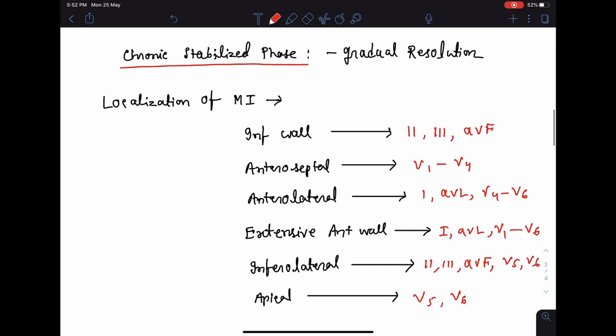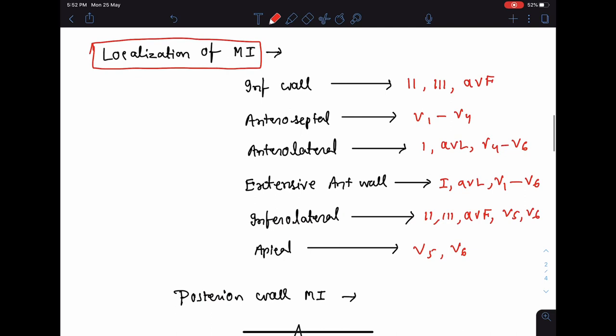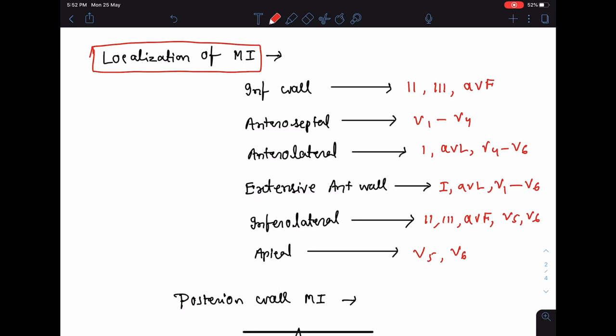Now, how do we localize myocardial infarction — how do we know which area or which wall is involved? We can determine this from various leads. The inferior wall of the left ventricle is represented by leads 2, 3, and AVF. If there are changes of myocardial infarction in leads 2, 3, or AVF, we can think there is involvement of the inferior wall. If the classic changes are found in V1 to V4, the area involved will be the anteroseptal wall.